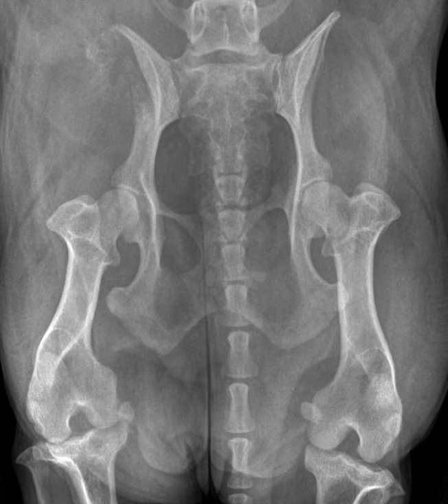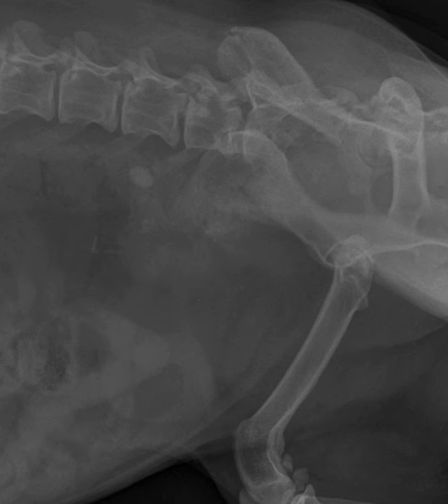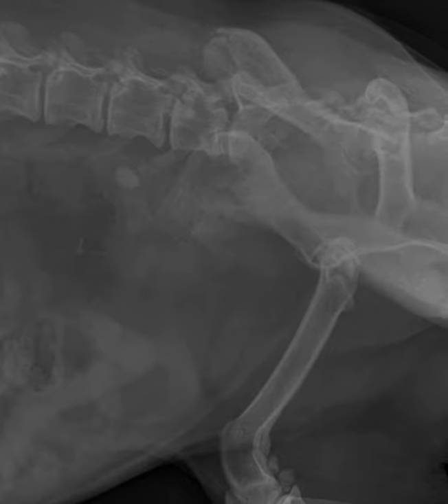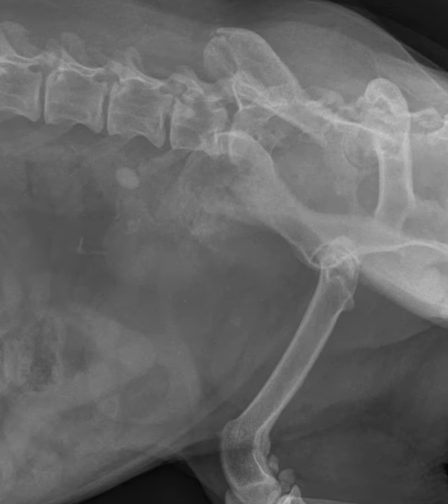I will give you a minute to look at the orthogonal views of the pelvis that were obtained. This is a ventrodorsal hip-extended view of the pelvis. And here is the corresponding orthogonal lateral view. You can see that the lateral view is slightly obliqued.